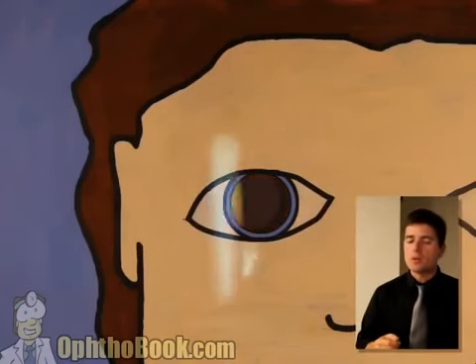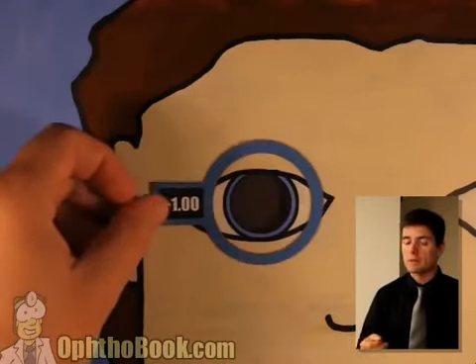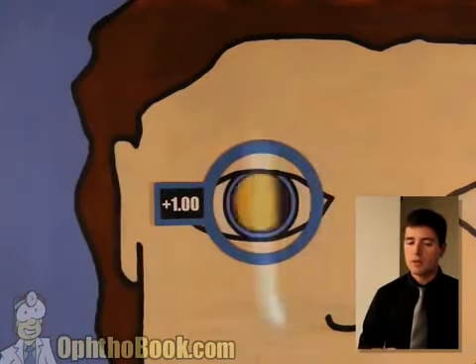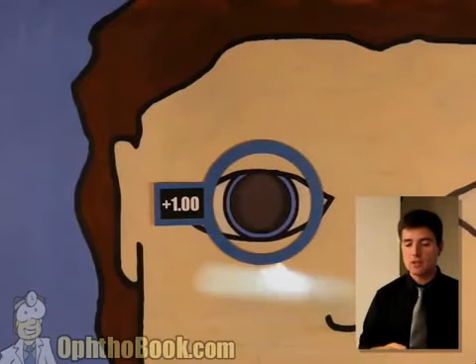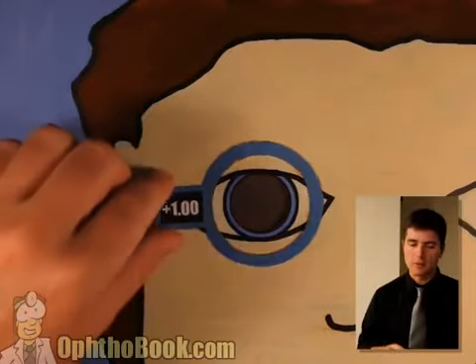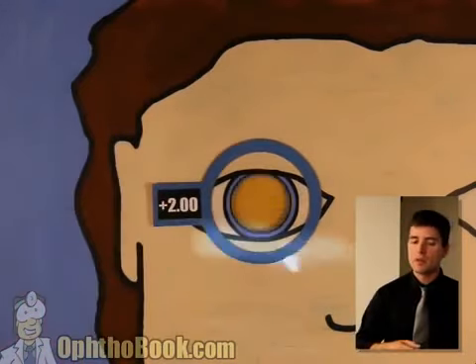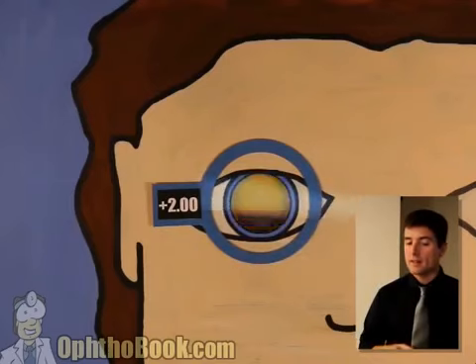Step 1, start with width. Good. We can proceed to step 2. Let's start adding some power. We'll add a +1. Okay, we're still not quite there yet. Let's check the other axis. Not quite there yet. We're getting there. Let's add another diopter of power. All right, +2. Let's try this. It looks like we maybe have hit it here. In fact, I think we have. Okay, let's check the other axis.